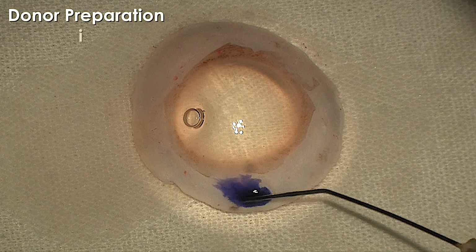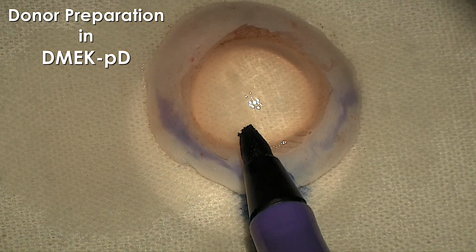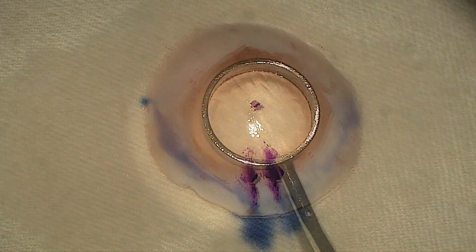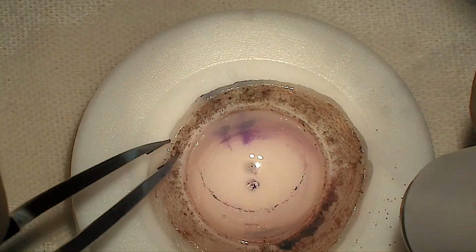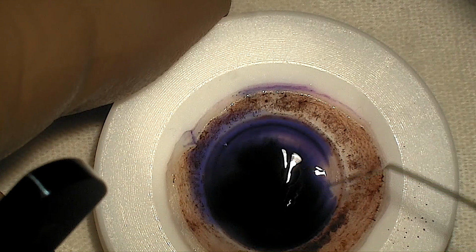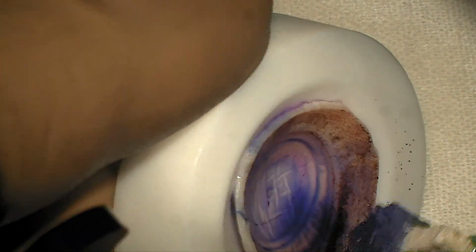During surgeon preparation of the DMEK PD graft, the technique is as follows. Using trypan blue dye, the previous 2 linear scratch marks are identified. These are then made prominent and extended to the peripheral cornea with a marker pen. An 8.5 mm template mark is placed on the epithelial side with superior eccentric location. The tissue is then flipped with the endothelial side up on a Teflon block, and a 9.5 mm partial trephination is done, again with superior eccentricity. Trypan blue dye is then applied to stain the cut margins.